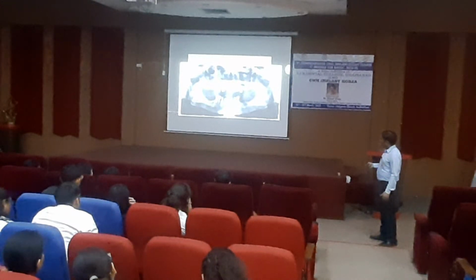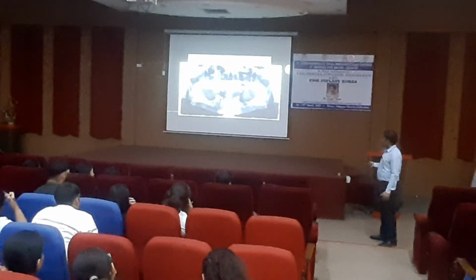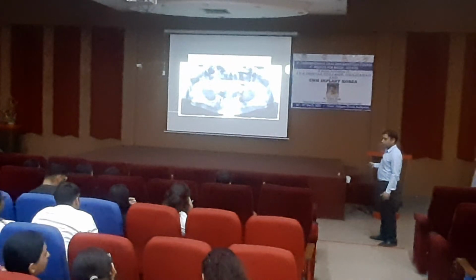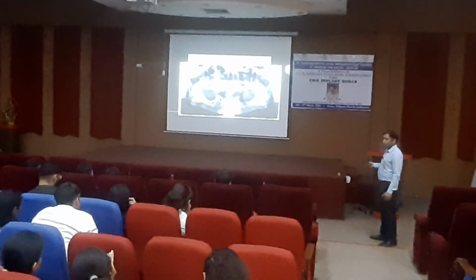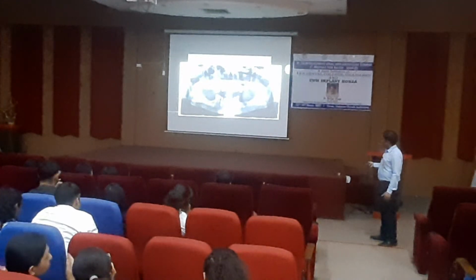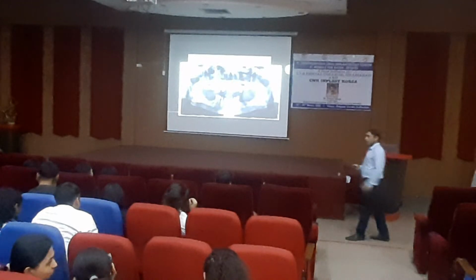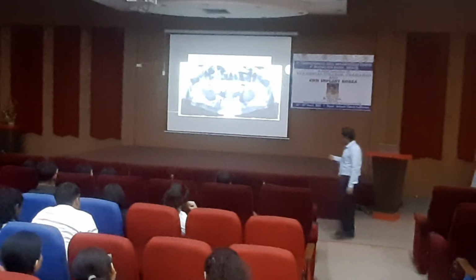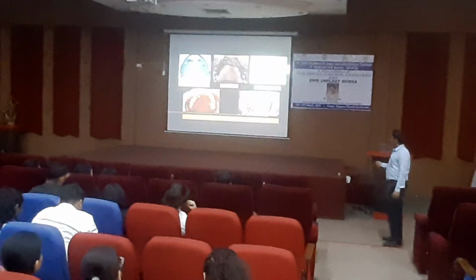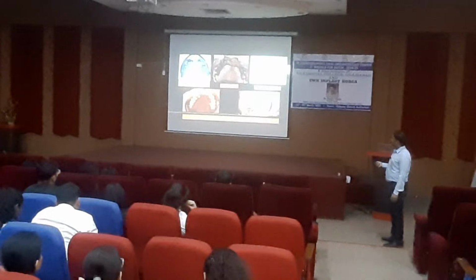Same here. This is around 17 degree. This is around 25 or 26, 28 degree, and this is 45 degree angulation. Okay, there is no bone in the center. Around the anterior nasal spine there is no bone as such. So we are putting a 6th implant premolar to premolar, and then we give the prosthesis like this.